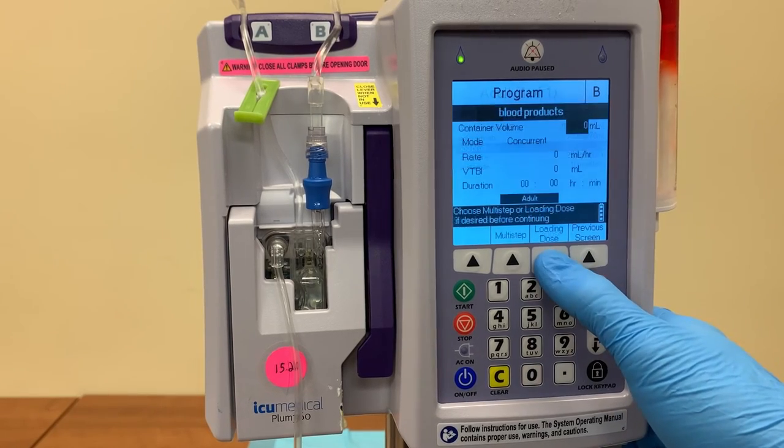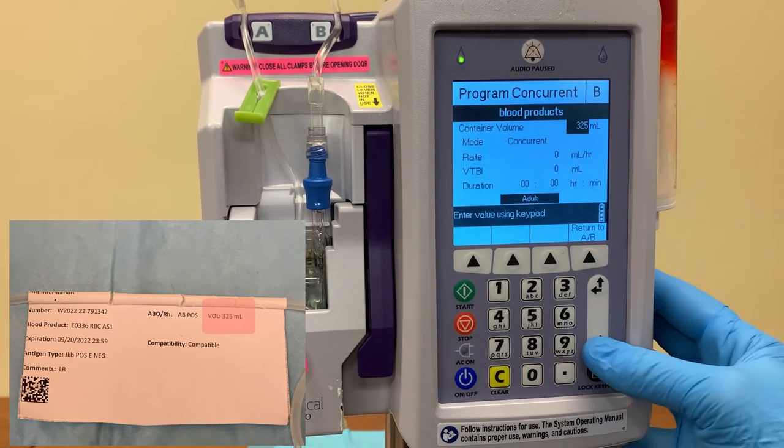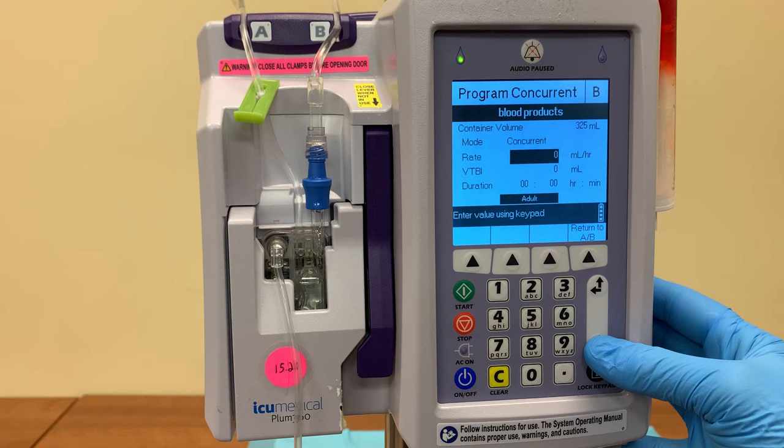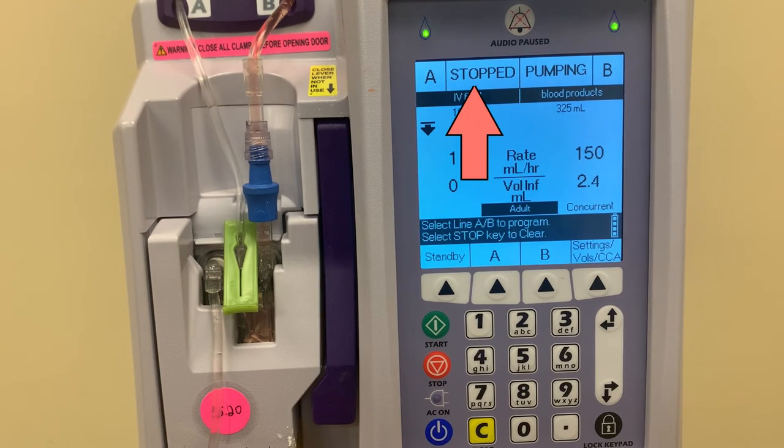Program the B line to blood products. Enter the total volume of the bag, which can be found on the sticker attached to the blood product bag. Every unit of blood is not the same, so always verify the volume before programming. You'll notice that the pump does not allow products to be run at anything other than concurrent. We don't really want any fluids added to the blood — it could lead to fluid overload — and that's why we set the A line rate to only 1 milliliter an hour, so even if both lines are running concurrently, essentially no fluid is being added to the blood. After programming the B line, make sure that the A line is stopped and the B line is running.